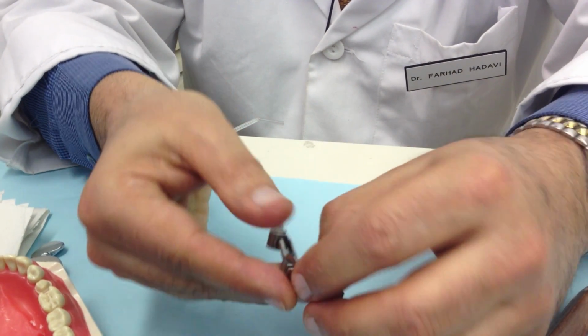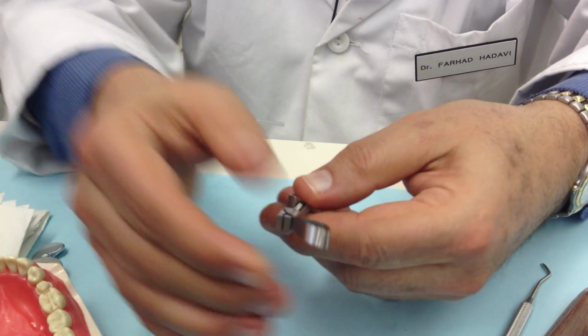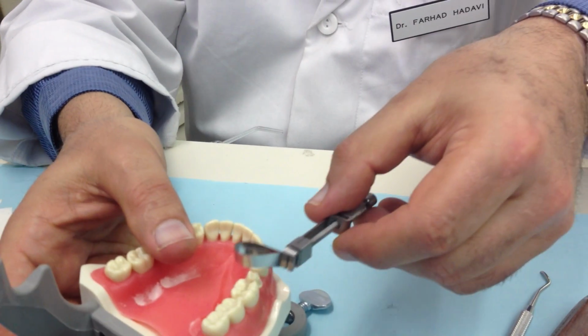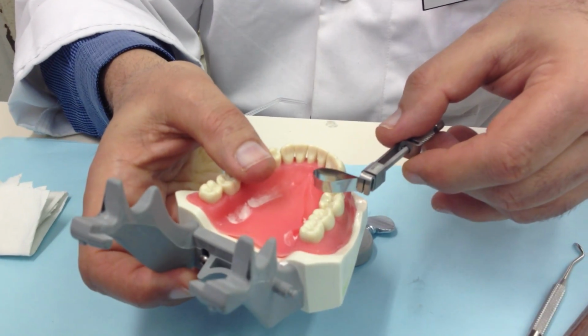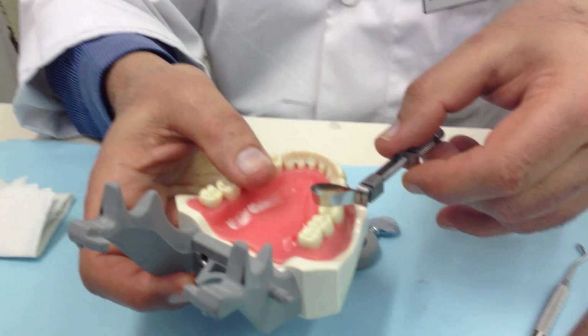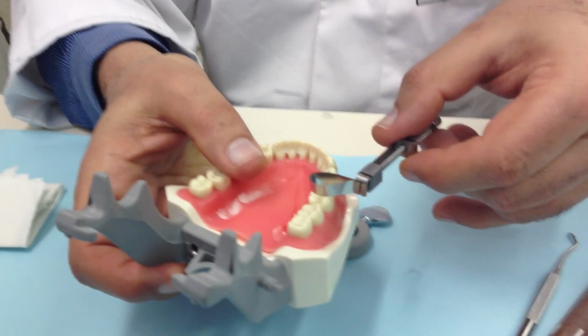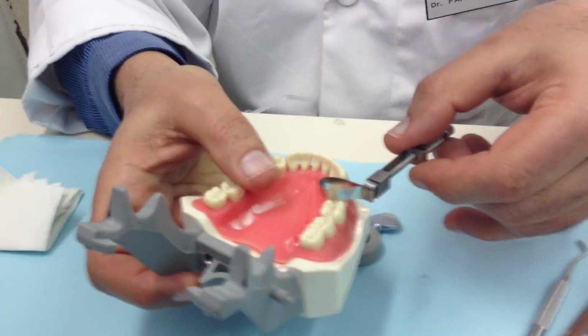So you can see I bring it nicely together, open this one. I know that, you can see if I take that one and place it over here, everything is correct. Am I right? Can you see it now?